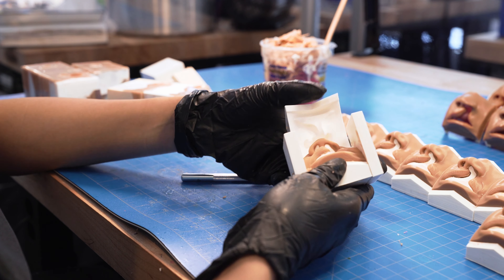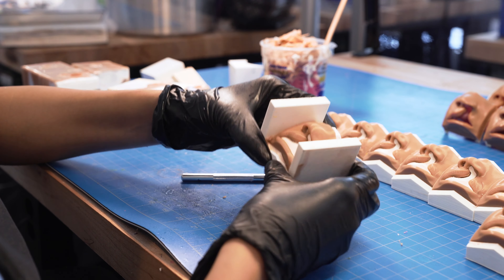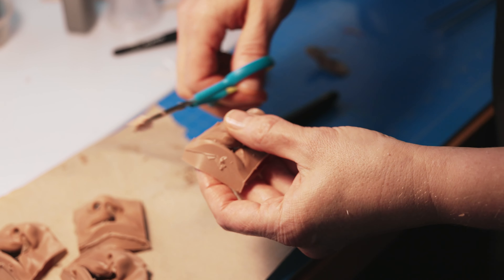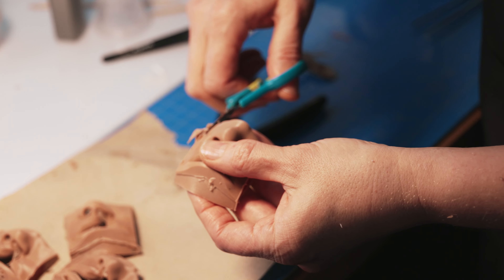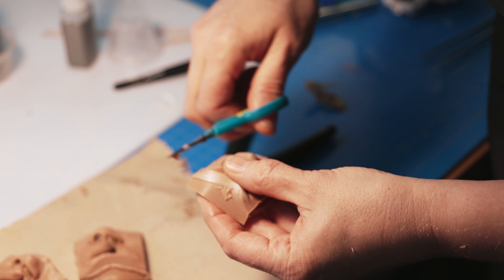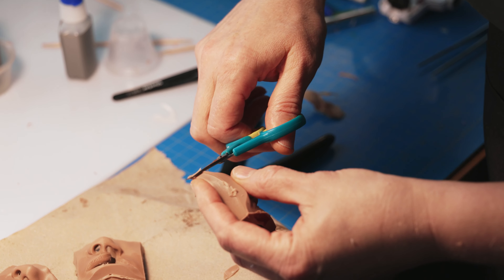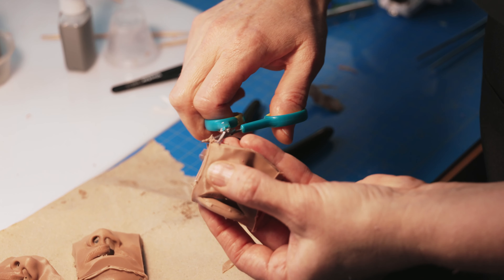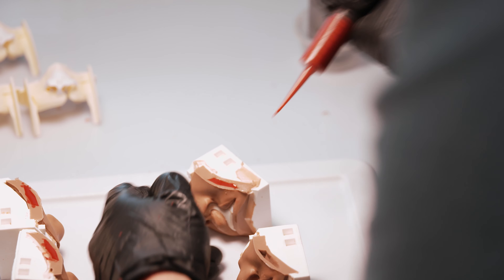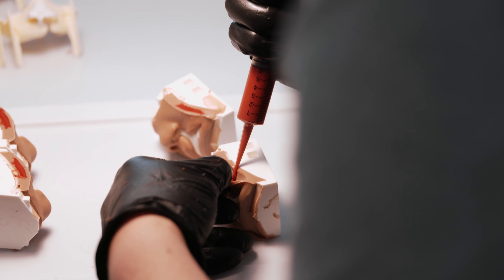After injection, the silicone cures into a solid object, which is then post-processed to remove excess material and to refine the suturing properties. During this stage, using trade secrets, we add additional material to improve the suturing properties for surgeons.